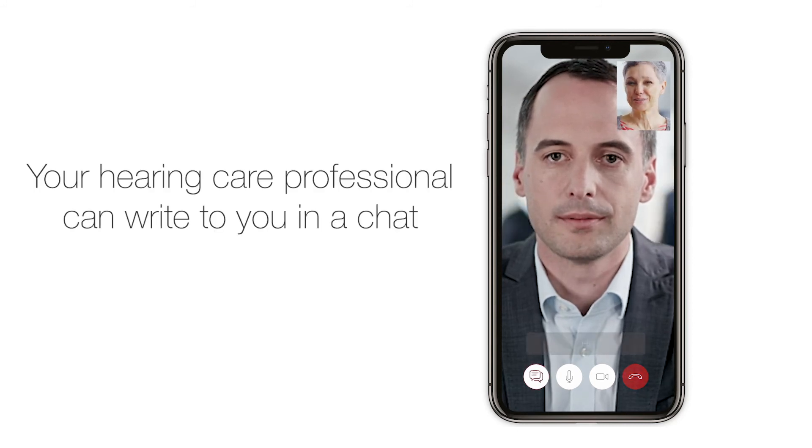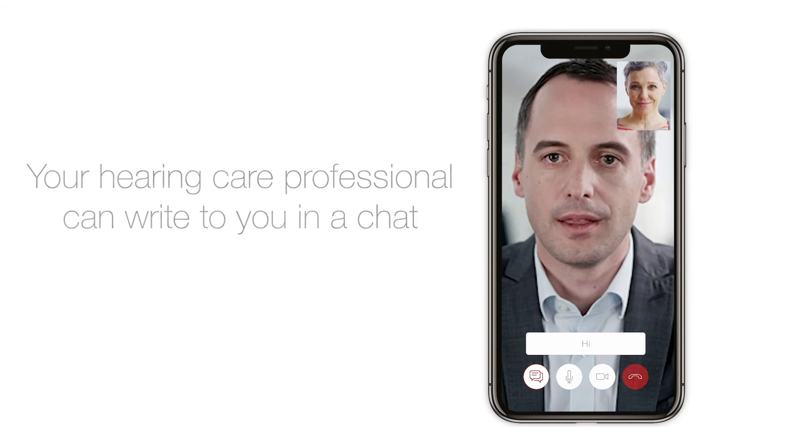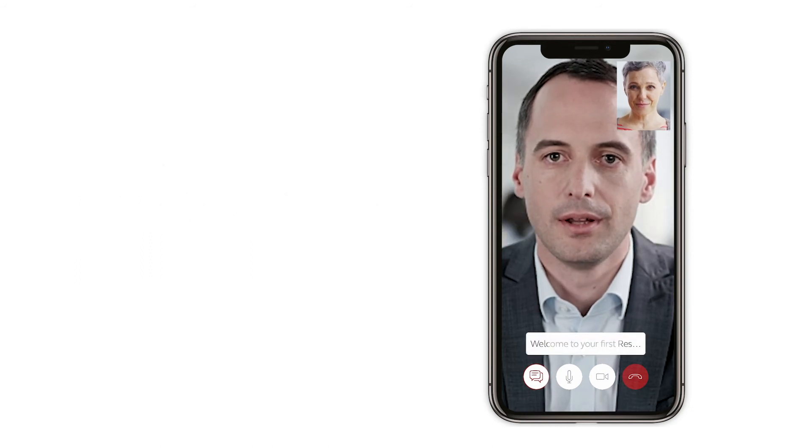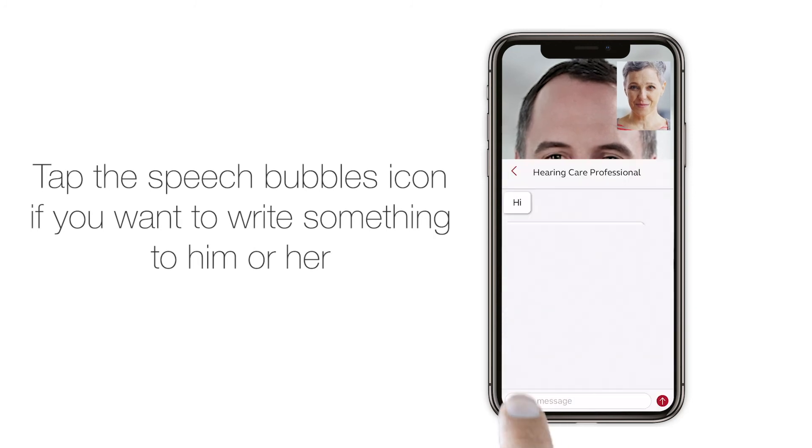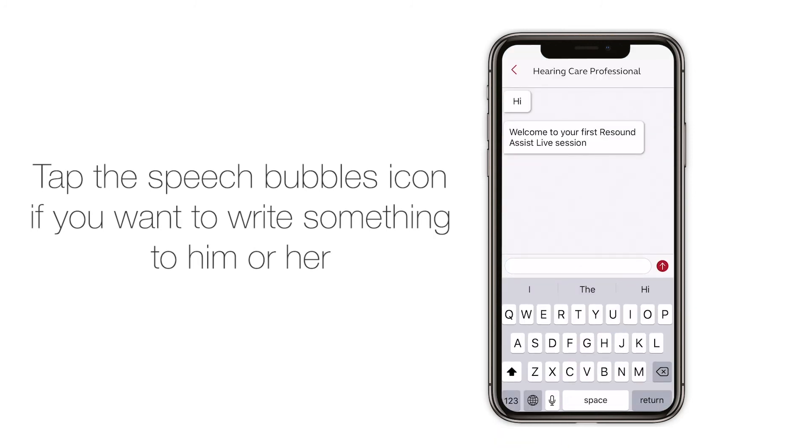Your hearing care professional can write to you in a chat. Tap the speech bubbles icon if you want to write something to them.